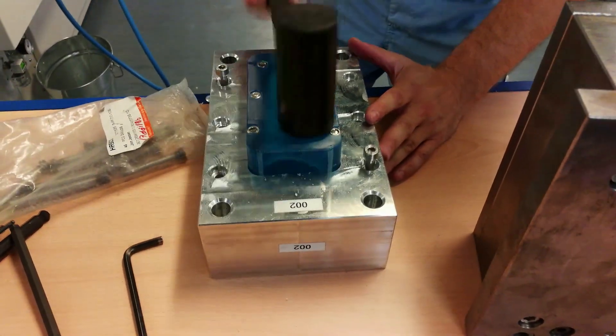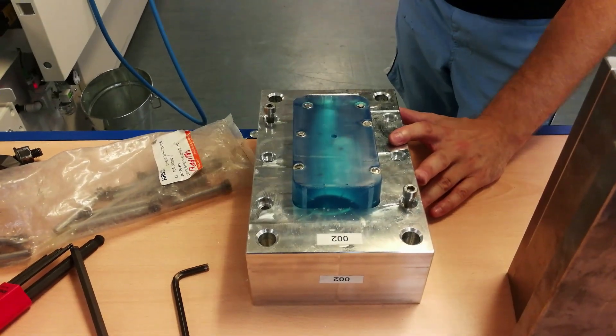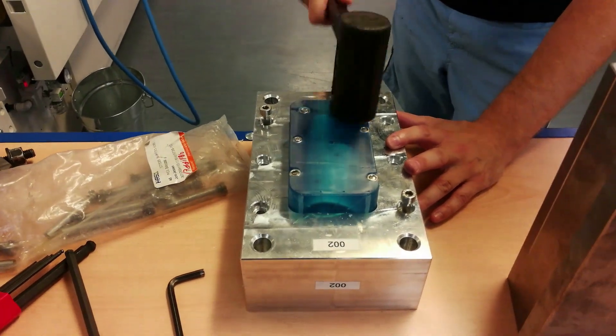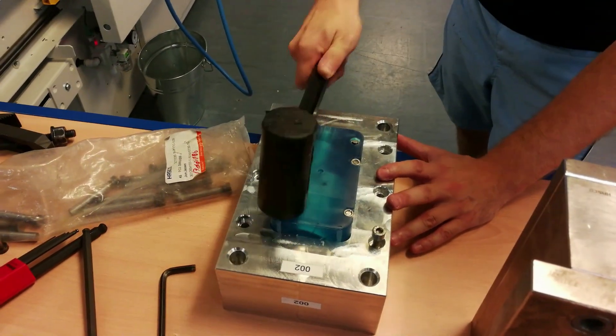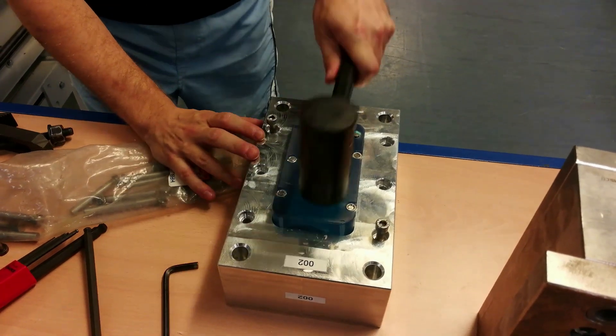For projects like this one that are a little outside the ordinary, we are using slightly more force than we would normally do. But the mold needs to have a very, very tight fit in the mold frame. Otherwise, we will inevitably wind up with a bulging that will not enhance the fit.